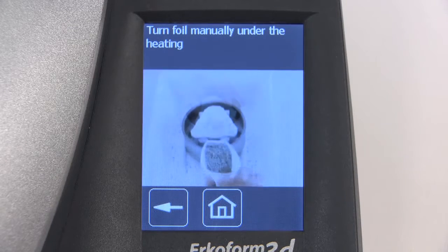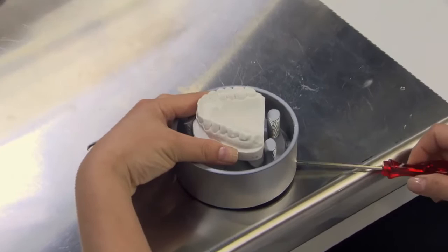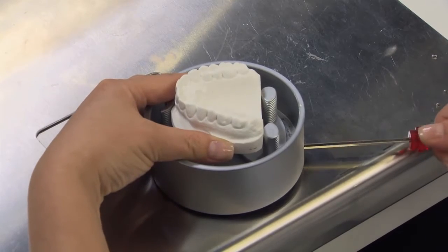A short clip will play on-screen detailing the next steps. With a hex screwdriver, secure the model to the pot, making sure the occlusal surface is tilted with the anteriors slightly higher than the posteriors.